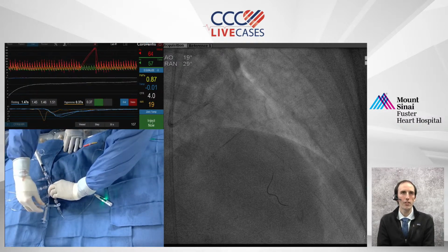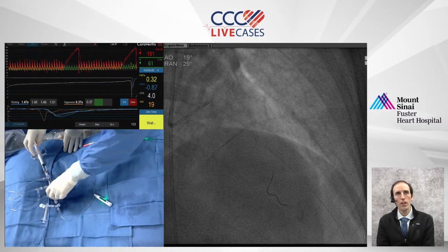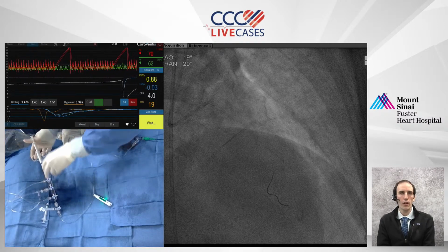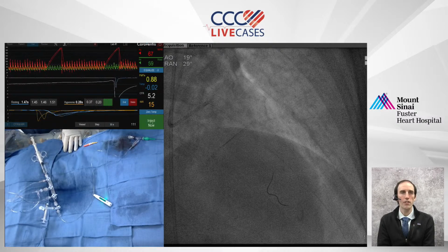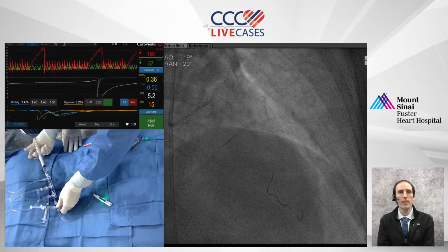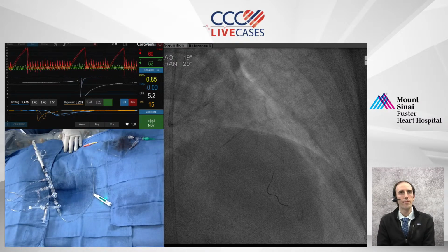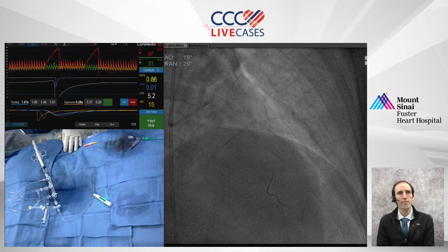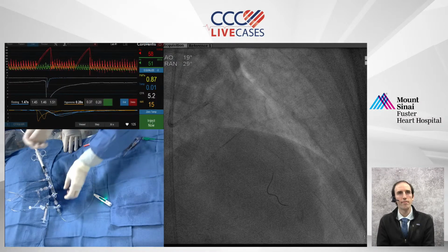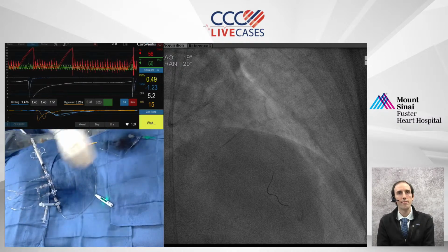Yeah. Our temperature's back to 0. So I find that when I'm measuring the hyperemic transit times, I get much more consistent and tight curves than with the baseline flows. I agree. And we're shifting. So our hyperemic curves are in orange, so we're shifting left here. She is augmenting flow very significantly. I mean, her flows now are 0.3 seconds. So our 0 back to 0, third, final one.